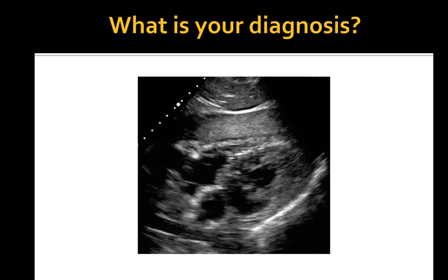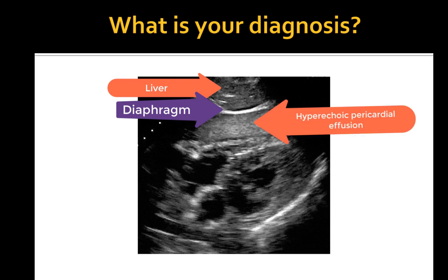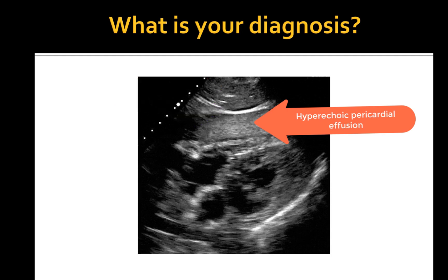Any ideas what's going on here? This is a sub-xiphoid view. The top of the screen represents a portion of the liver, separated by a thick hyperechoic bright line which is the summation of the diaphragm and pericardial sac. Next, there is a thick layer of hyperechoic pericardial effusion. This patient has a hemopericardium and its pericardial space is occupied by clotted blood.